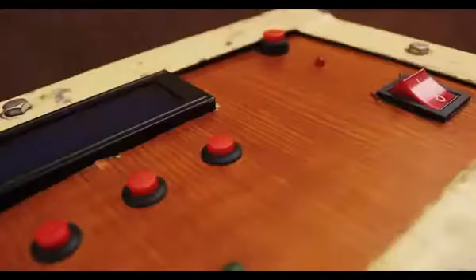The major materials used in producing this machine are the HDF plywood, which was used in making a frame that houses the Ambu bag and the mechanism, while the MDF plywood is used in covering the body of the machine, and then the angle rod to build up the frame in order to carry the weight of the battery and the machine.